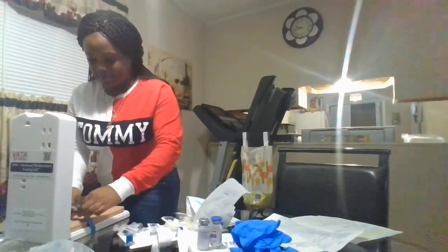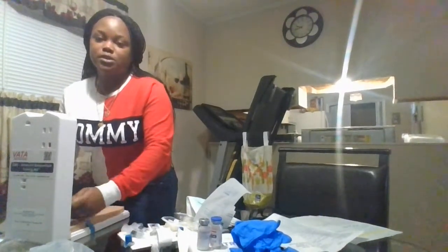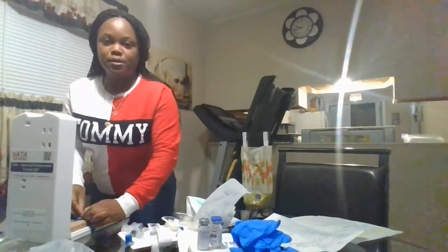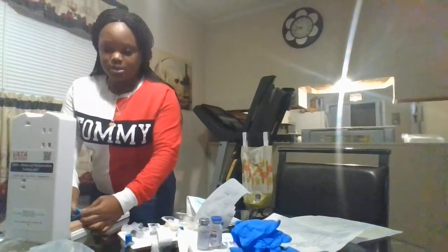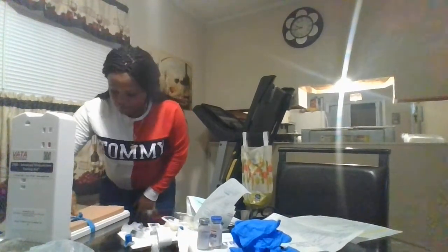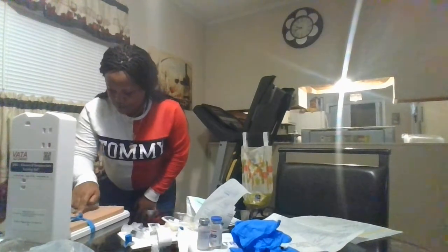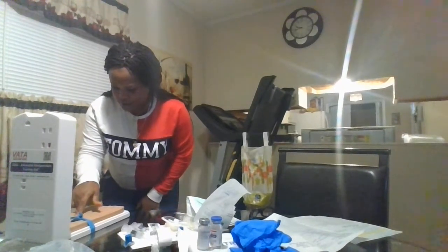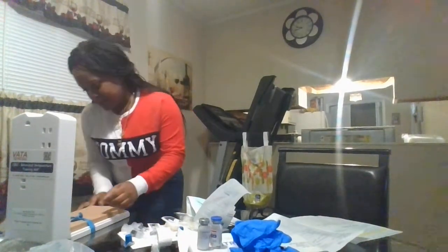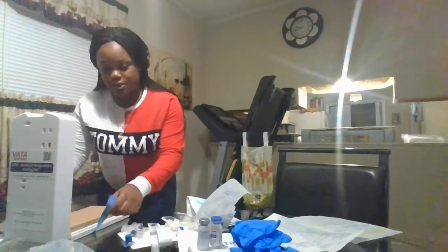I'm putting it on the upper extremity and checking my distal area for good palpation and a good vein. All right, that's a big, good pulsation right there, so we're going to use that one. Is that okay, Mr. Jack? Yes, okay. And I'll check for pulse. Pulse is present. All right, I'm going to release my tourniquet.